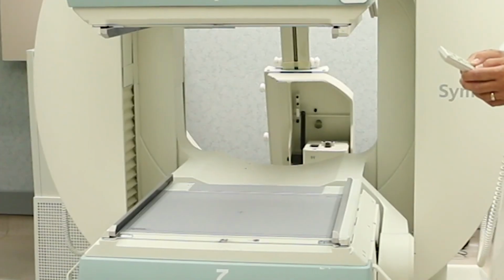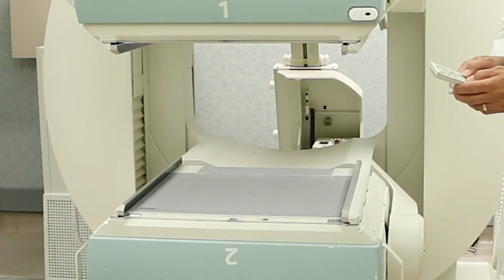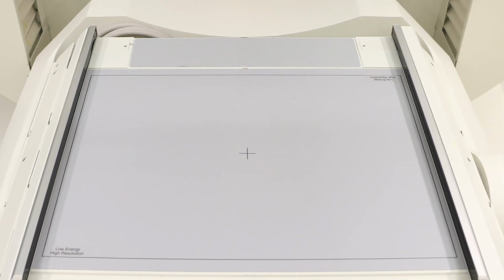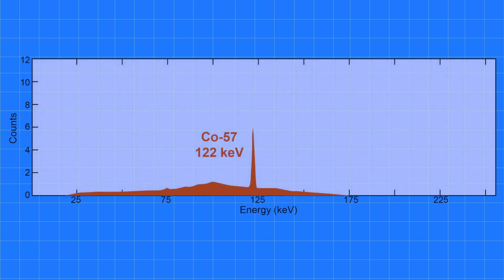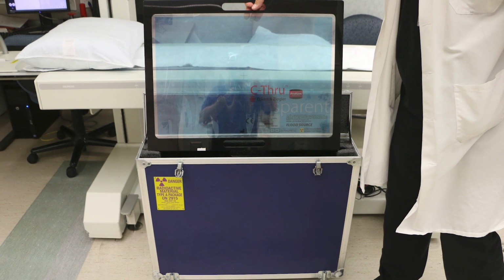The advantage of this test is that it allows us to test the electronics or the uniformity of the machine and also to check for collimator damage. Cobalt 57 is the preferred source as it provides a uniform gamma ray source similar in profile to technetium 99m. Each sheet of cobalt 57 impregnated plastic has a half-life of 272 days and needs replacing every 2 years.